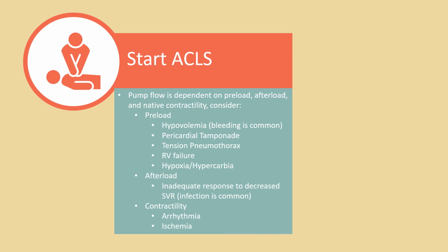Afterload is an interesting thing to consider. Your usual things that lead to a drop in SVR, like sepsis or anaphylaxis, your normal body has ways to compensate for this. Your heart rate goes up, stroke volume increases, those sorts of things.